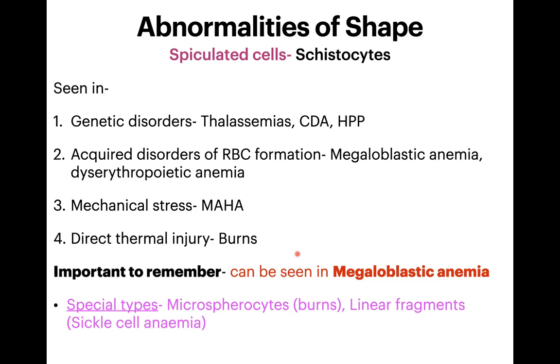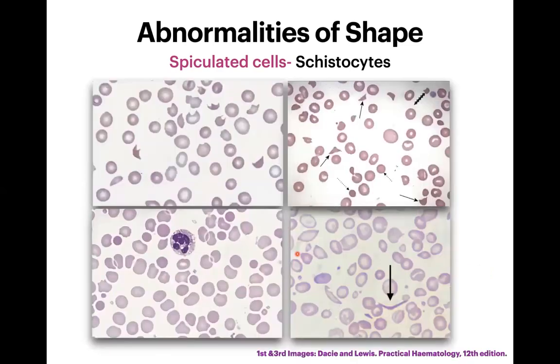There are certain special types of schistocytes: microspherocytes are found in cases of burns, and linear fragments are found in sickle cell anemia. In the images shown, the first image demonstrates irregular shapes with spines; the second shows a triangular cell, a helmet-shaped cell, microspherocytes, and an irregularly contoured cell — all of which should be called schistocytes, not by different names. The microspherocytes shown are from a burn case. The linear fragment seen in sickle cell anemia is a schistocyte, not a sickle cell.